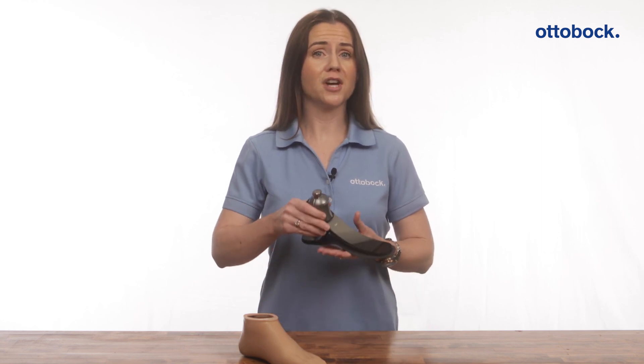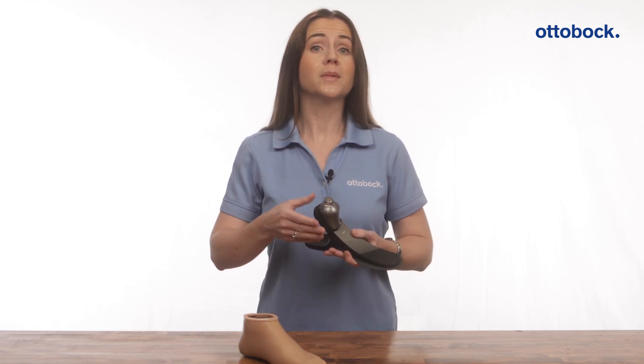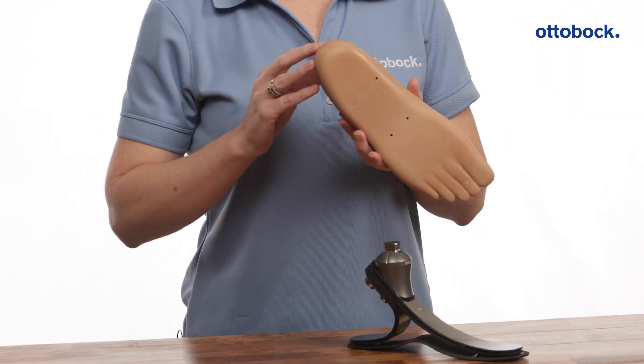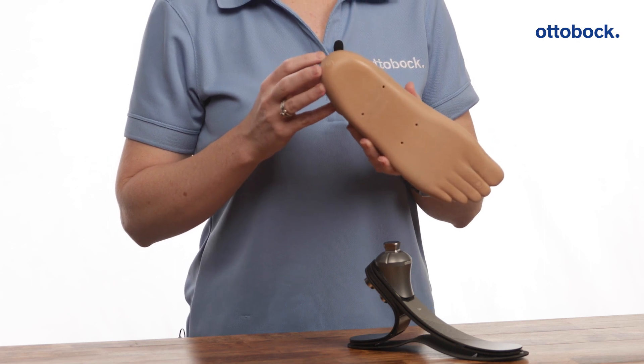The water runoff channels prevent water from collecting inside the tube adapter, and holes in the new foot shell allow drainage after submersion in water.